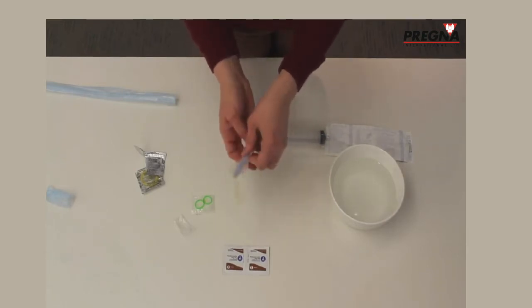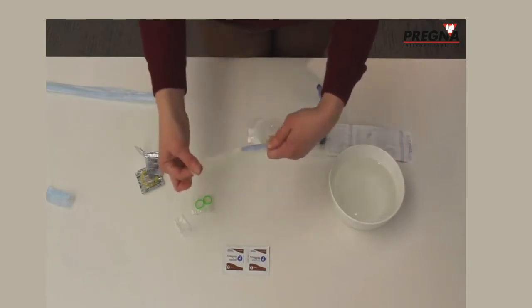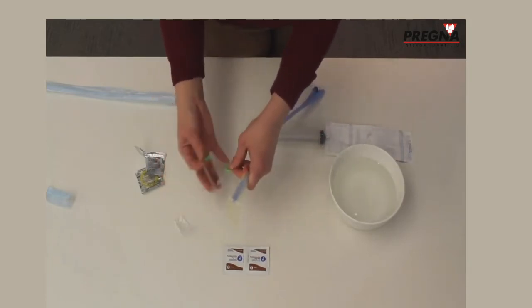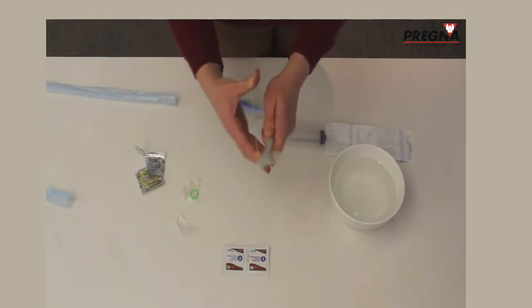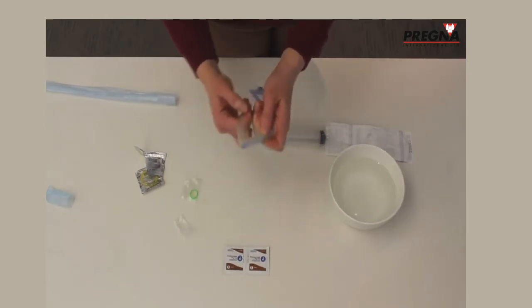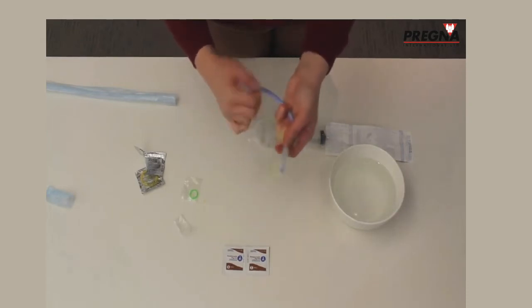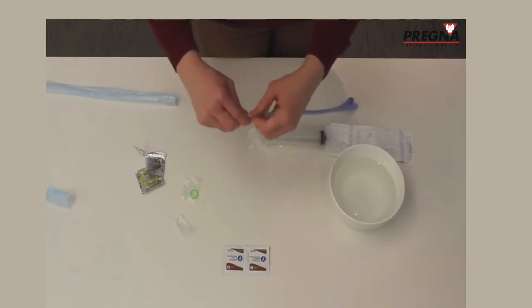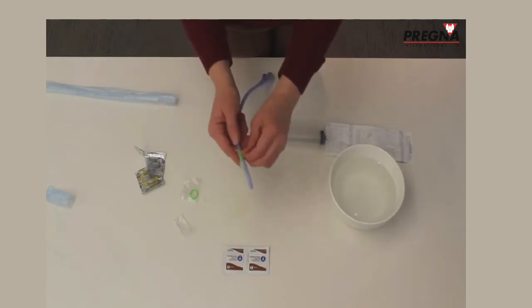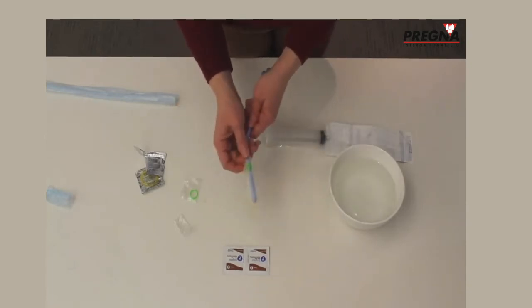About halfway into the condom, use one of your O-rings — the O-ring should go around 4 times. Place the O-ring below the Foley balloon, because you are going to inflate the little balloon at the end of the Foley, just like you do when placing the Foley in the bladder. 4 times around should be strong enough to keep the condom on when you inflate it.